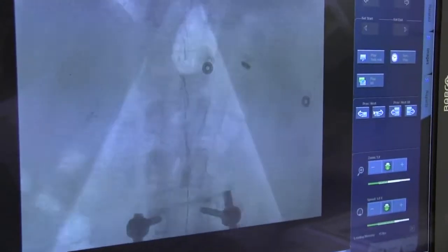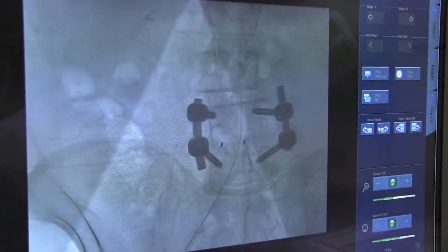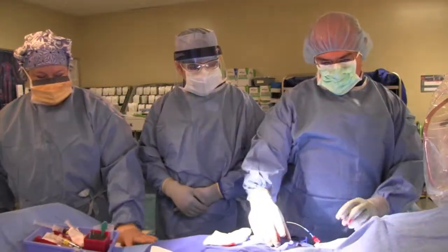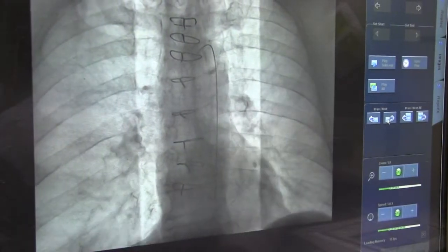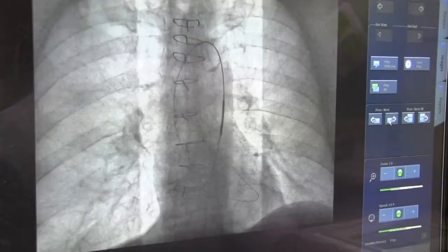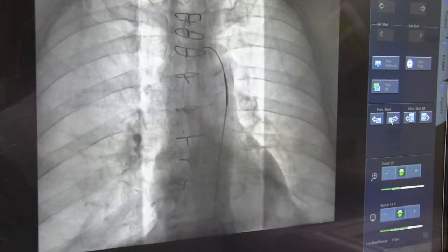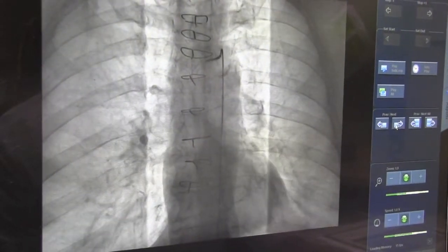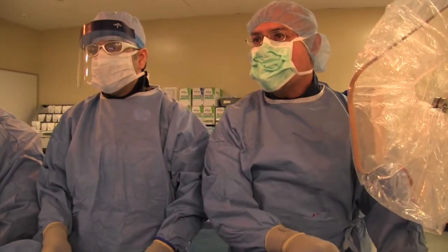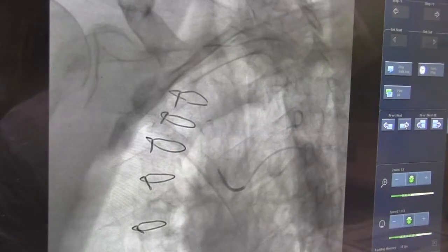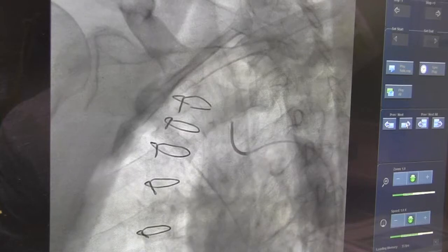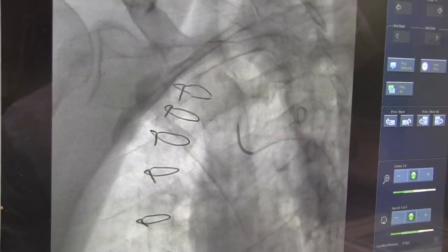Here we're accessing the artery and advancing a guidewire, then advancing a longer wire up into the aortic arch, which allows us to advance our shuttle sheath over the aortic arch near the brachiocephalic artery — the artery we need to access to approach the carotid artery in this case. This image demonstrates us engaging the brachiocephalic artery with our slip catheter.